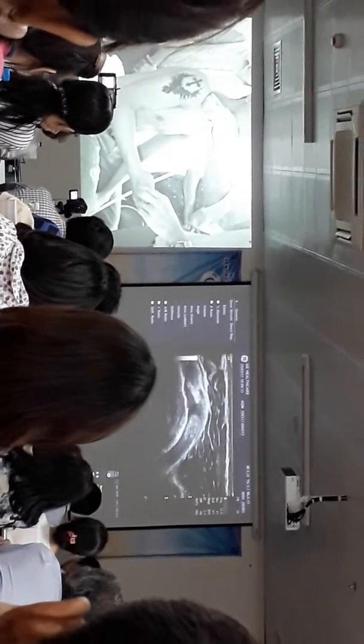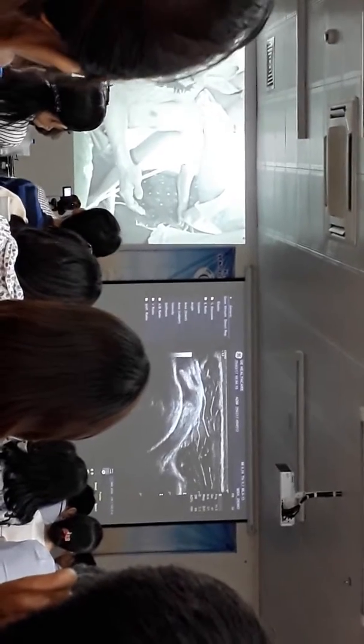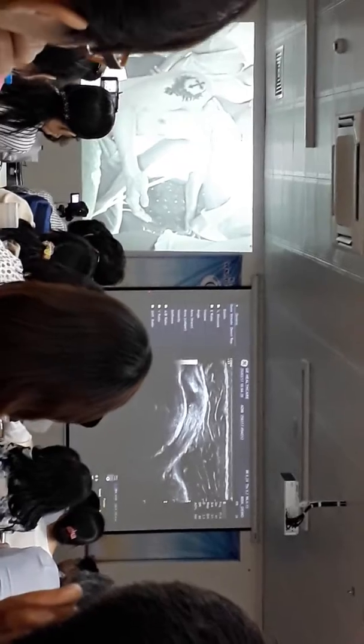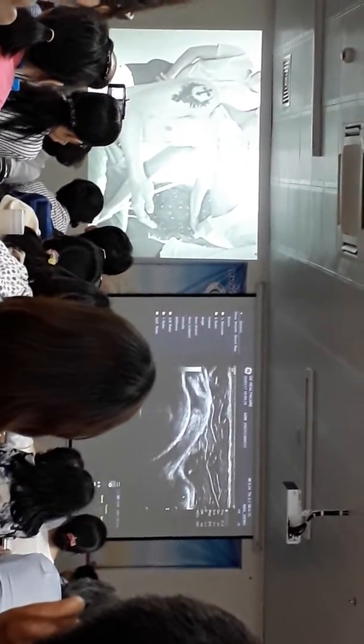So we have a look at the subscapularis. Now I examine the tendon on the right. So once again, using our long head of biceps as our landmark, anterior to it is the subscapularis.